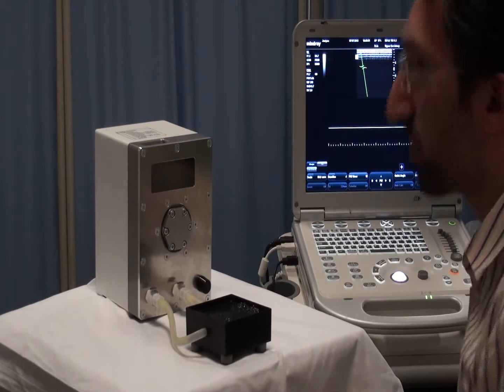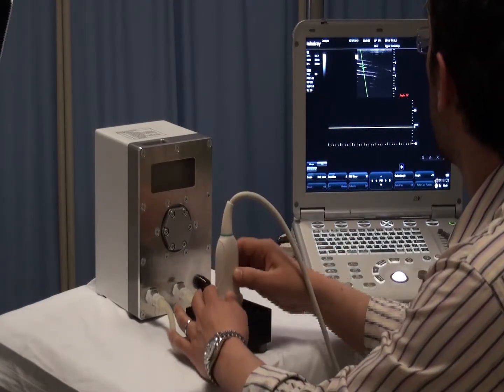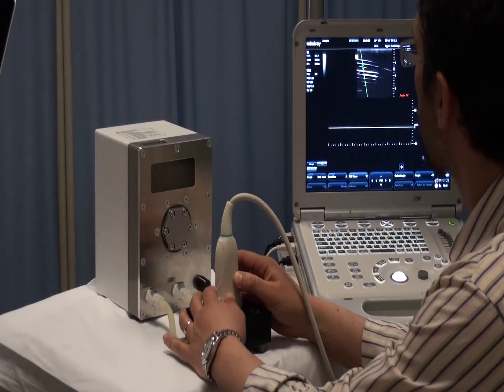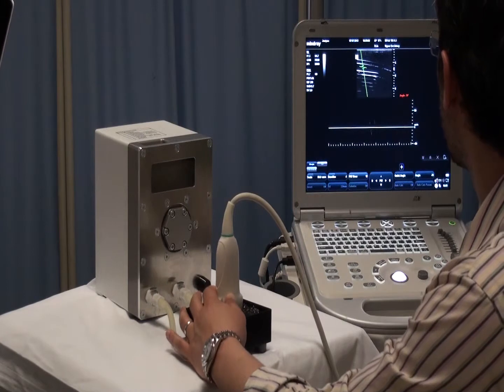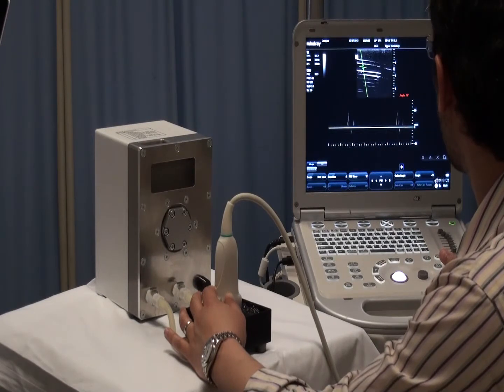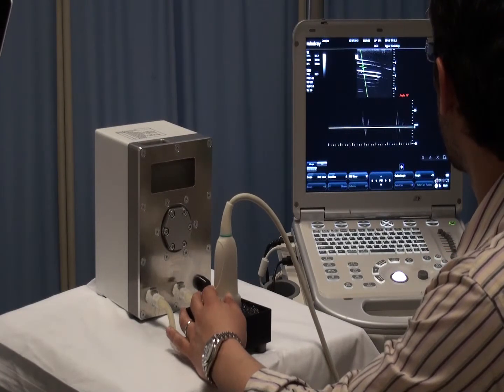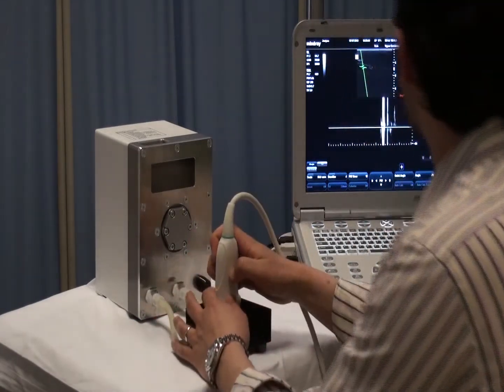We'll start off with a common femoral waveform. I'll show you what the phantom looks like, the standard phantom that comes with the machine. Here we can see a straight tube phantom. You can see that we have both B mode image and the spectral Doppler. I think we need a little bit more gel.